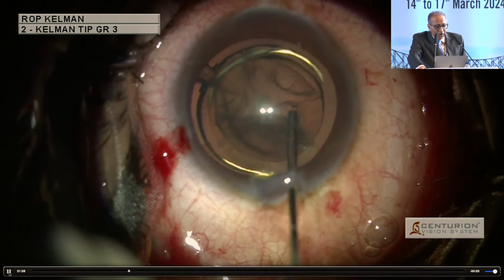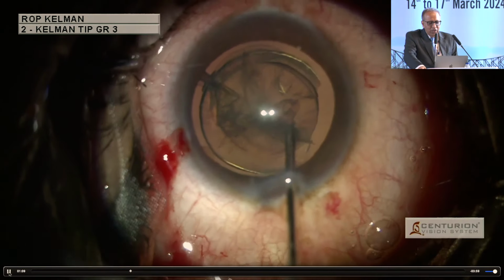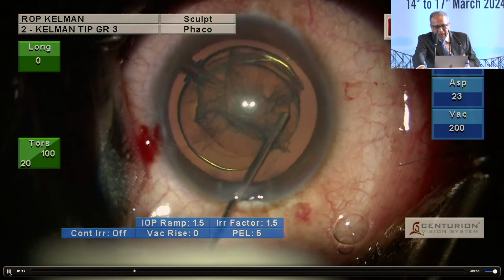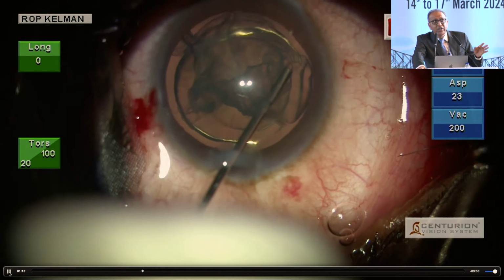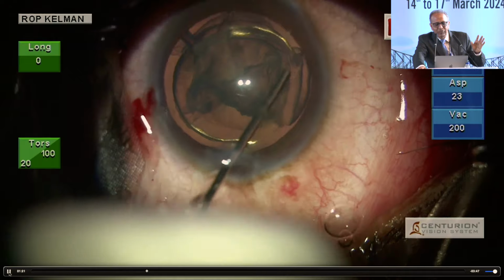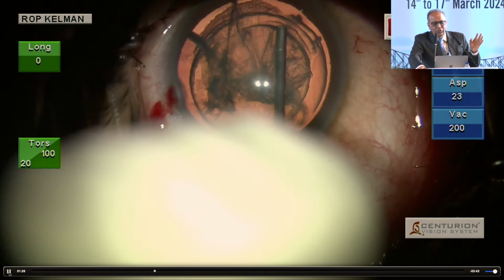This is risky. You have to be fully adept in using this technique, and you have to get used to it in your normal practice when you come across patients with soft cataracts. Because if you do not know how to do it, you can create a situation where it can cause sudden hydrodissection and a blowout. So I am doing it at different planes and at different places so that I am able to create 3 or 4 layers so that I have a shield. I do not have direct contact whatsoever with the posterior capsule.